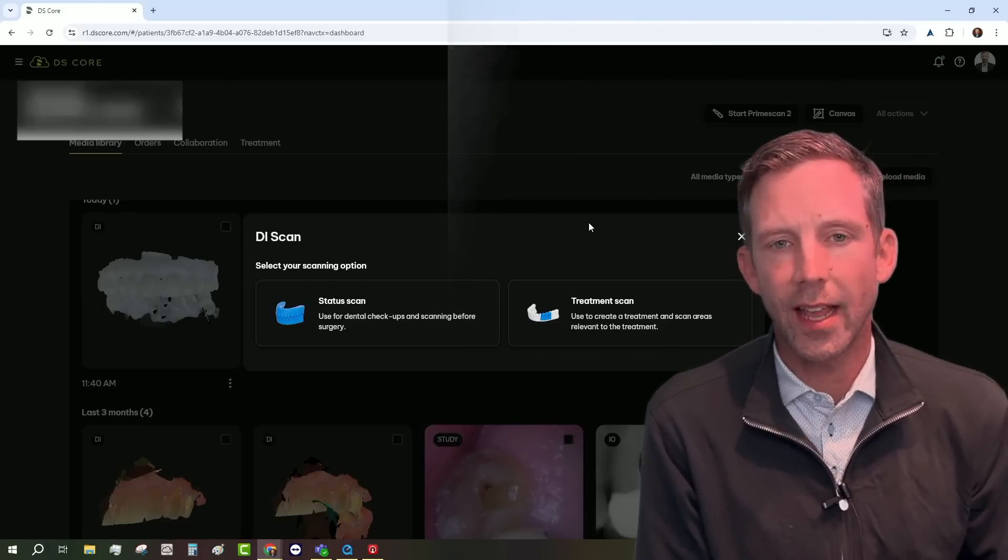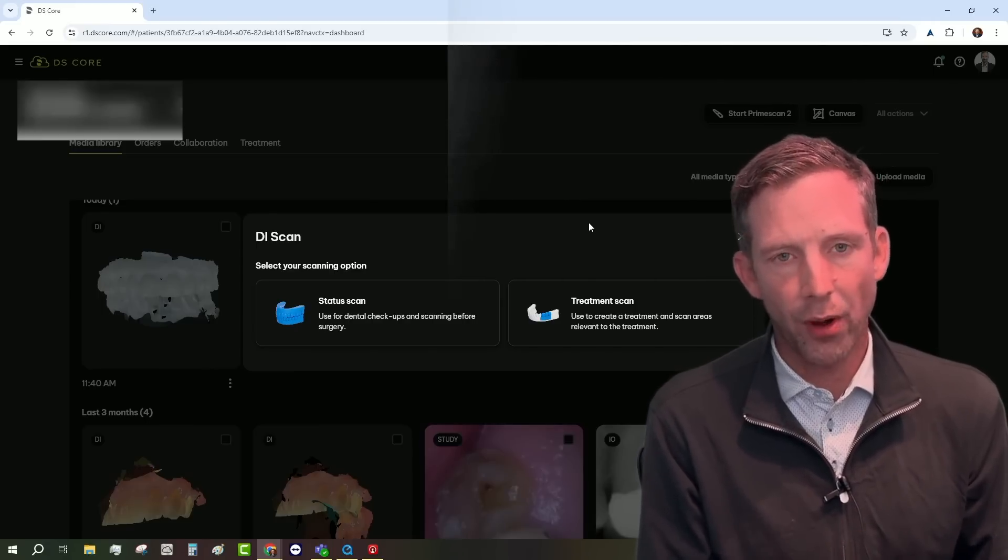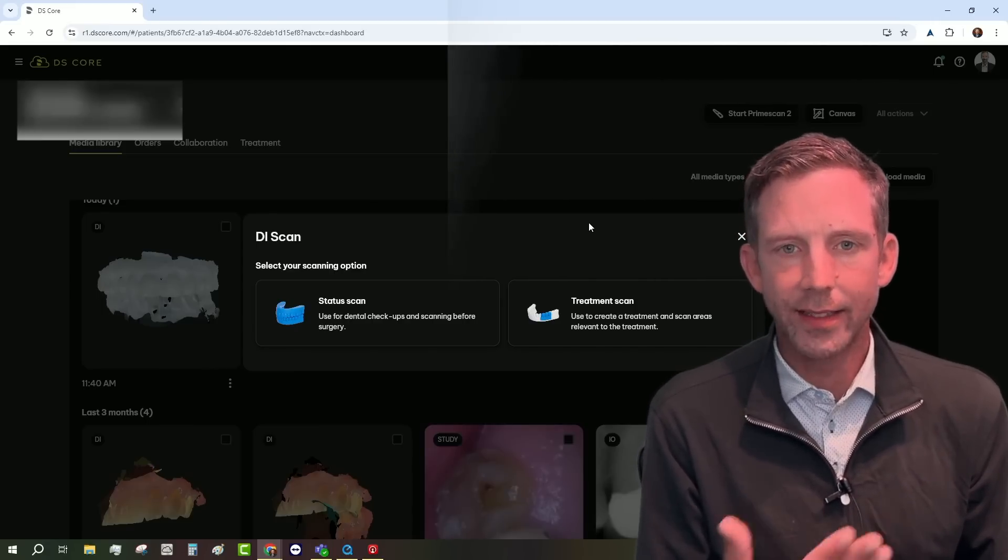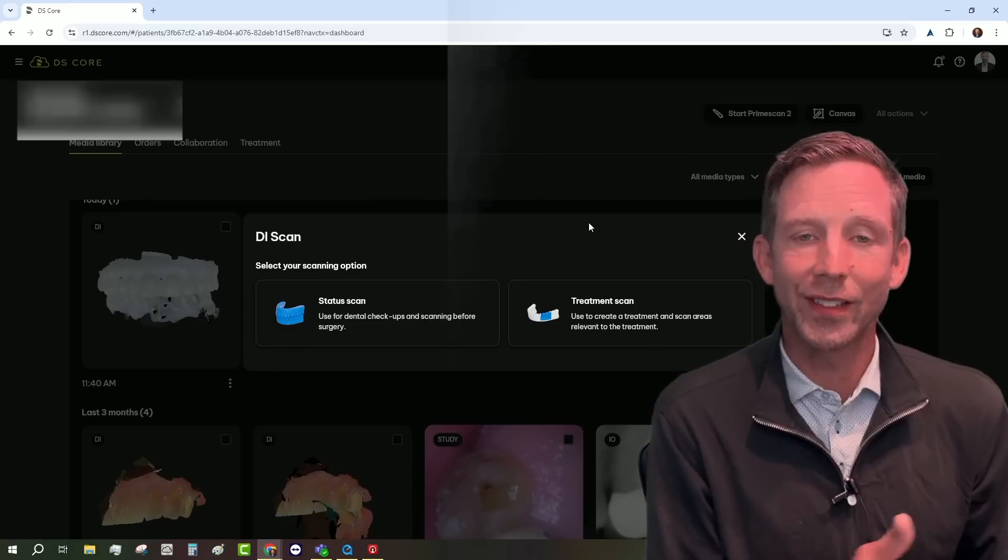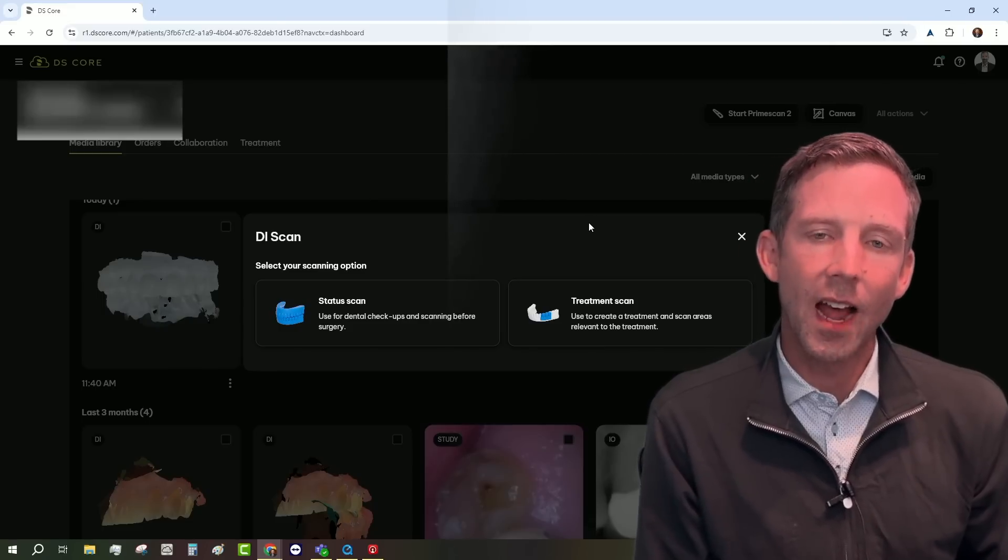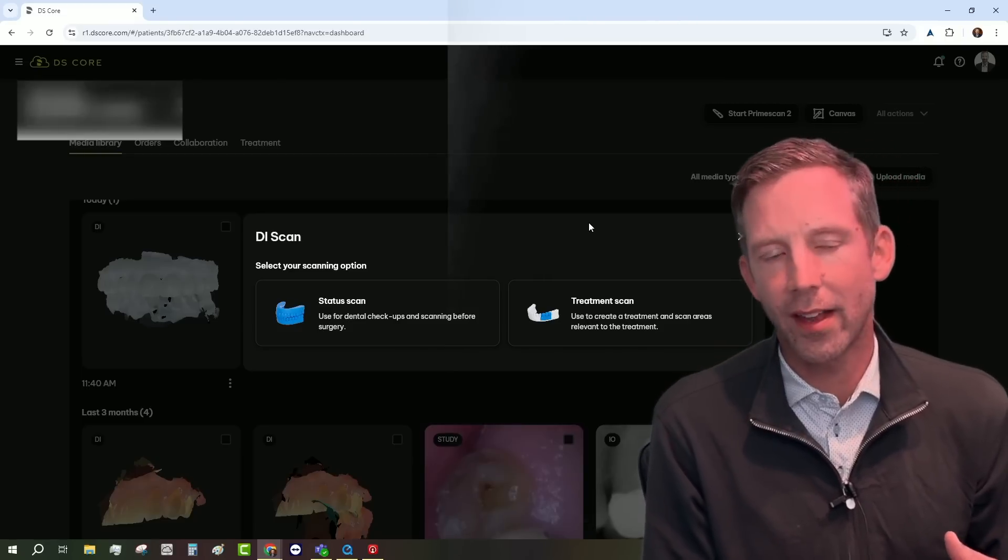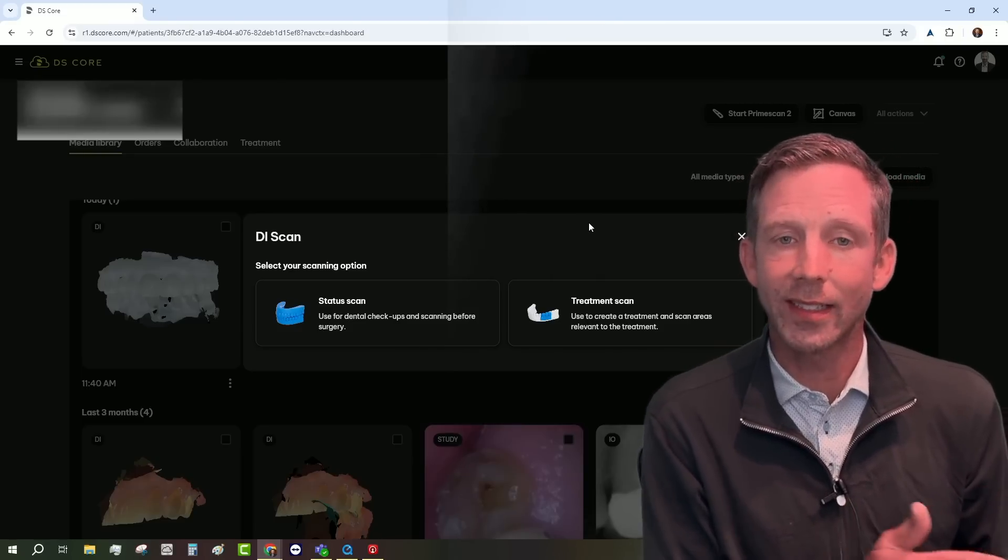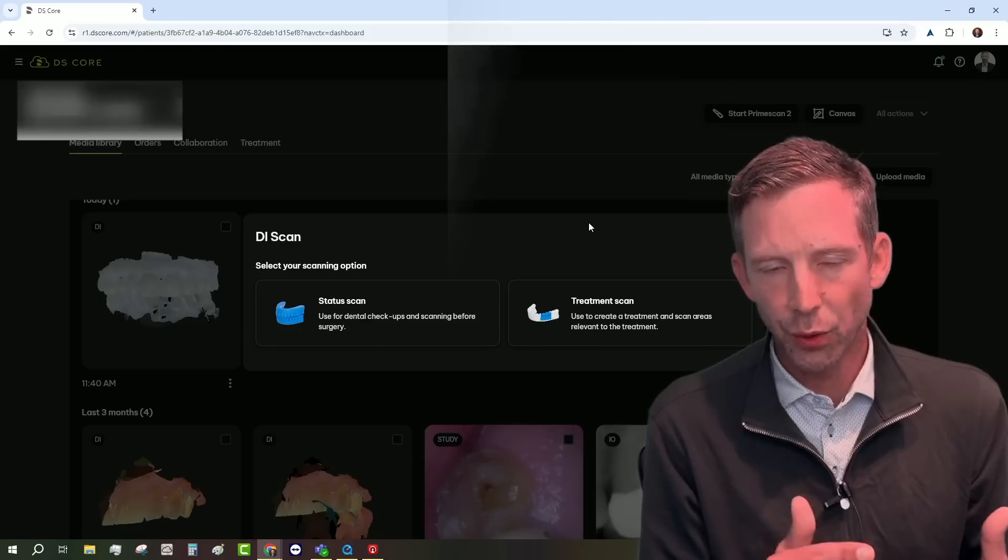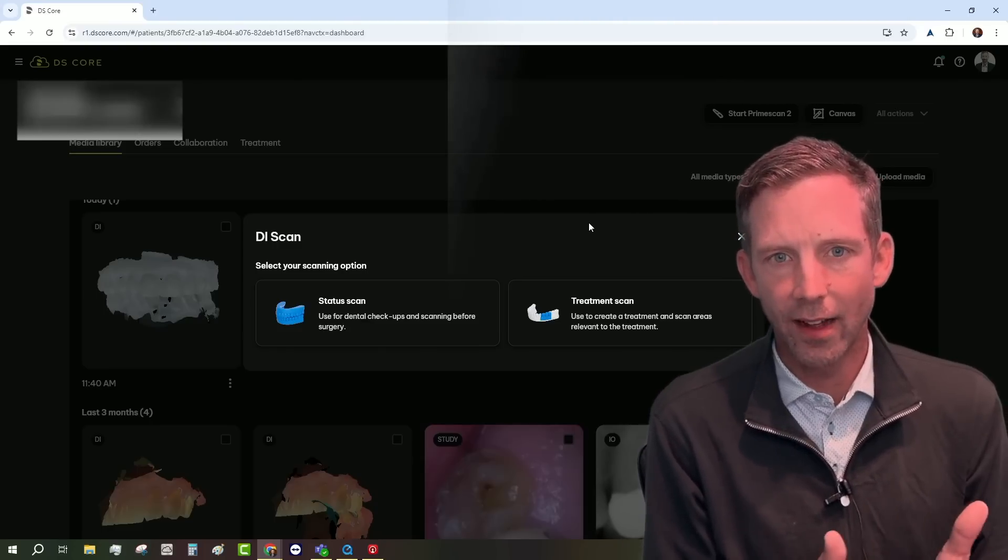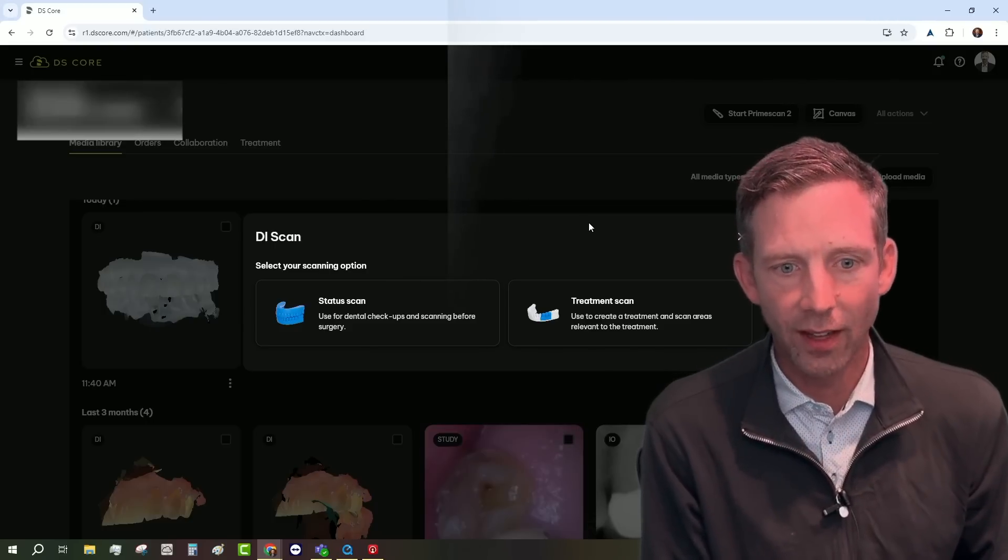Now, a treatment scan is obviously a treatment scan, meaning if I'm doing a crown, a veneer, a denture, or anything that's going to require treatment, then we're gonna select treatment scan. Now, there's one little twist to this, and I'll show you that in a little bit, and that's using our status scan to fill in the treatment plan. It's a really cool application that is brand new with PrimeScan 2 that I think you're going to love.